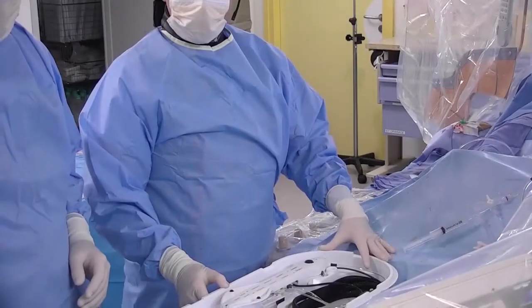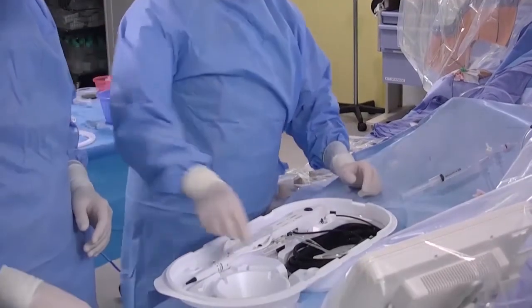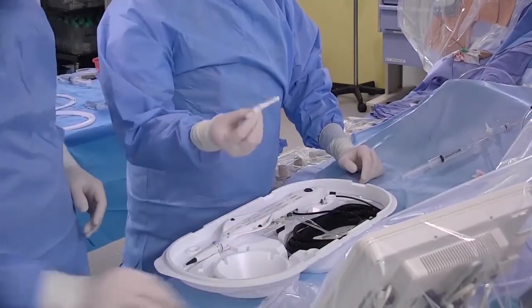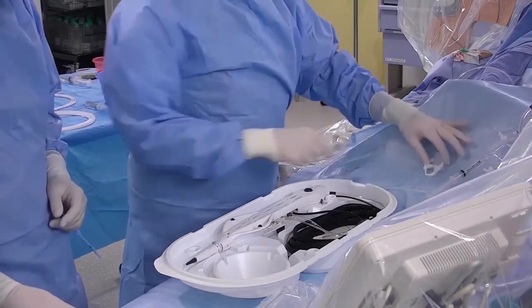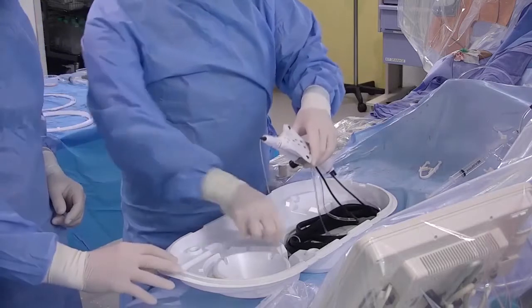Can you see the box? Yeah. Okay, perhaps yes, we can. We can see it well now. So this is, we will use it. I will show you after. This is a clip.